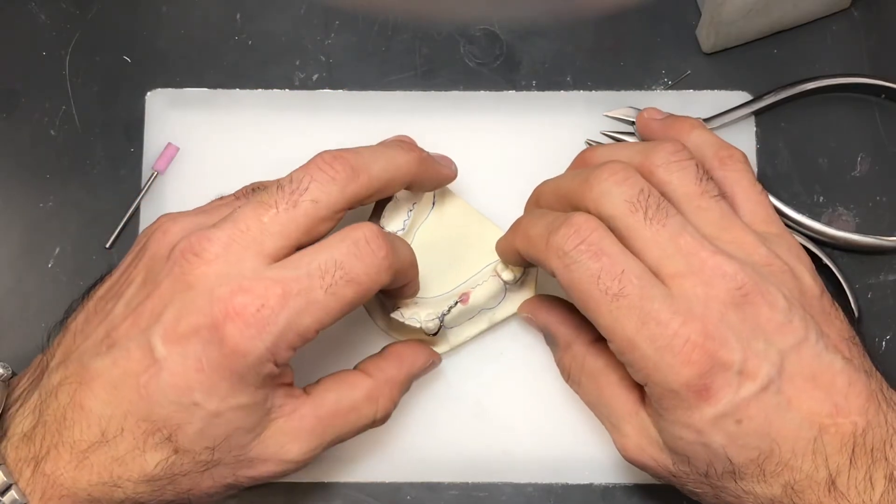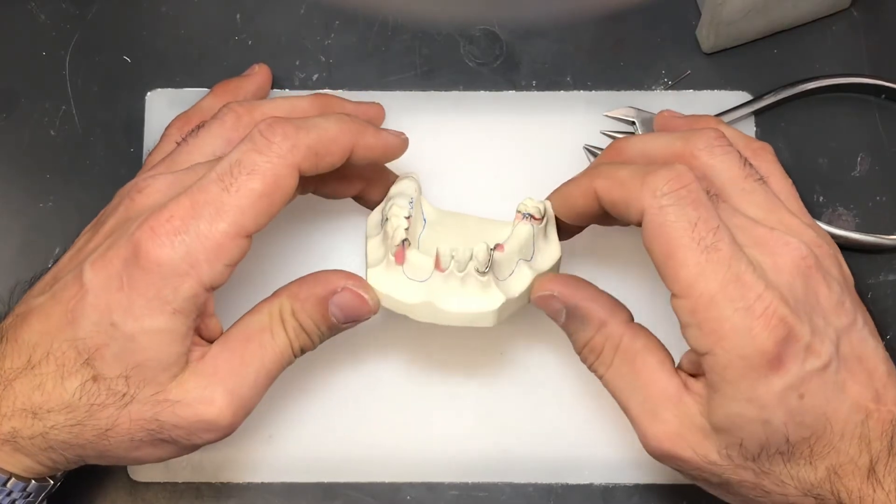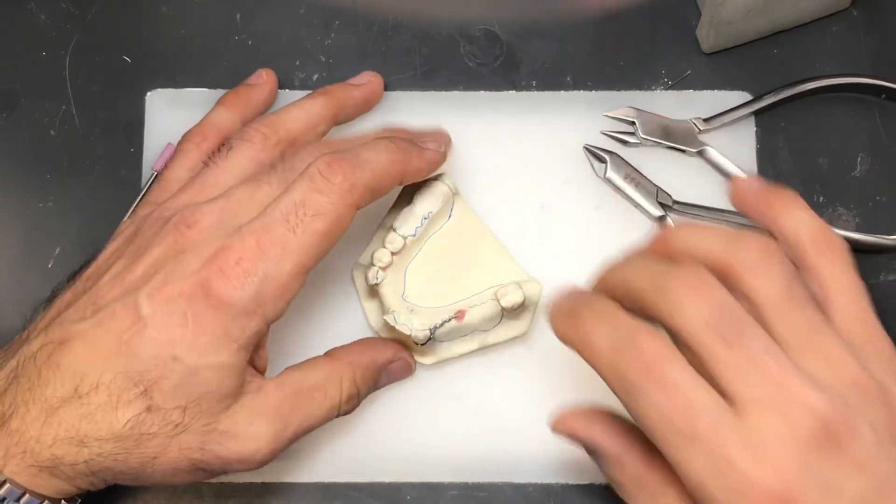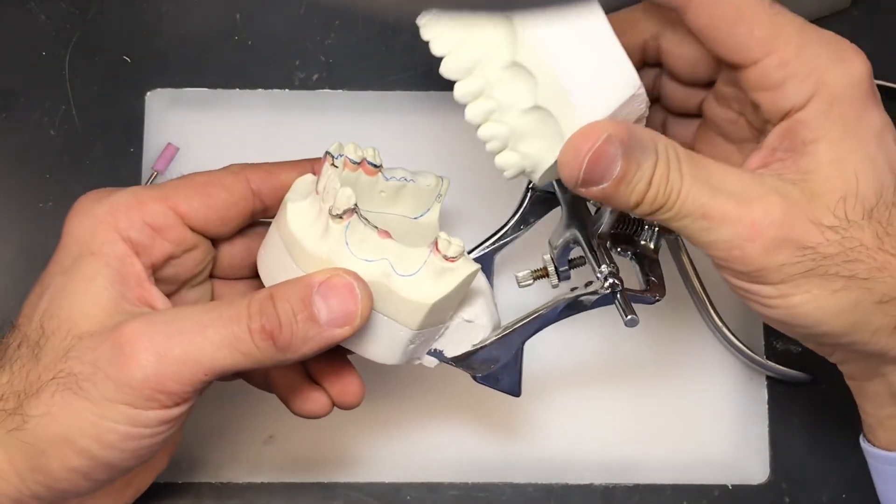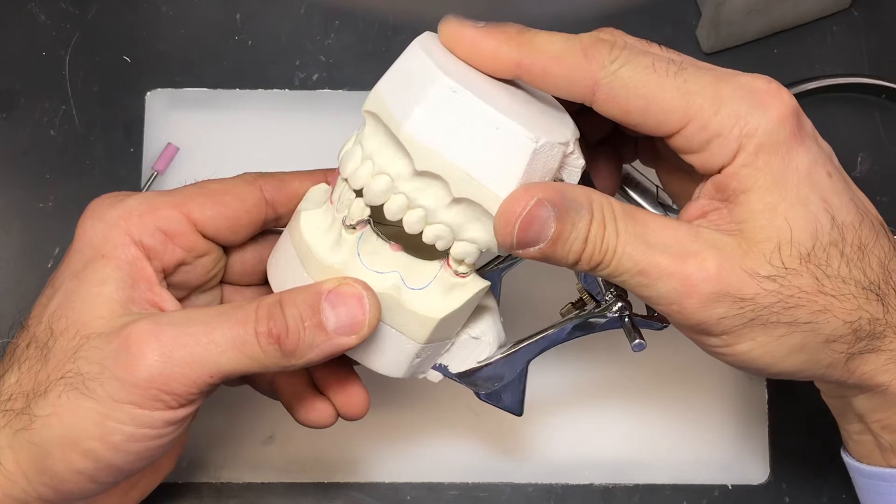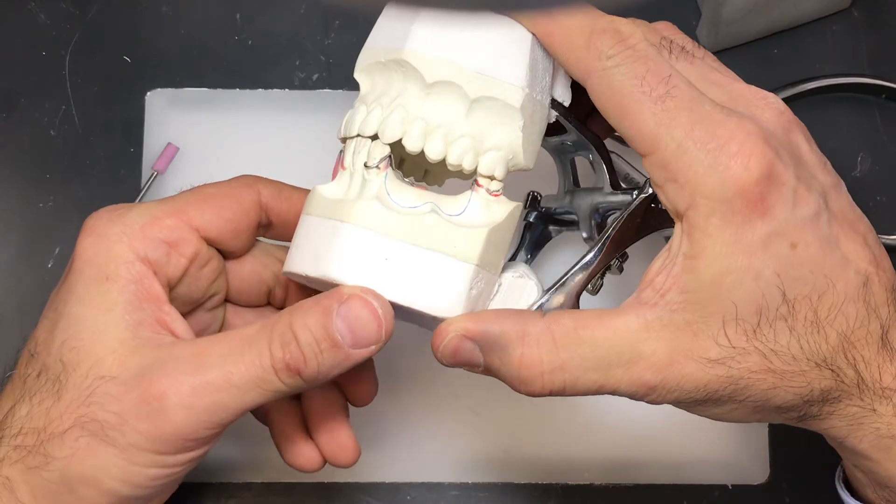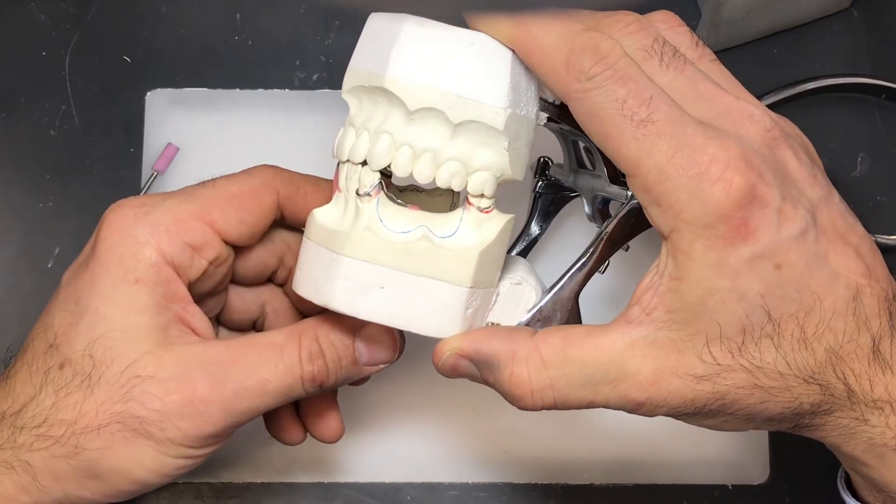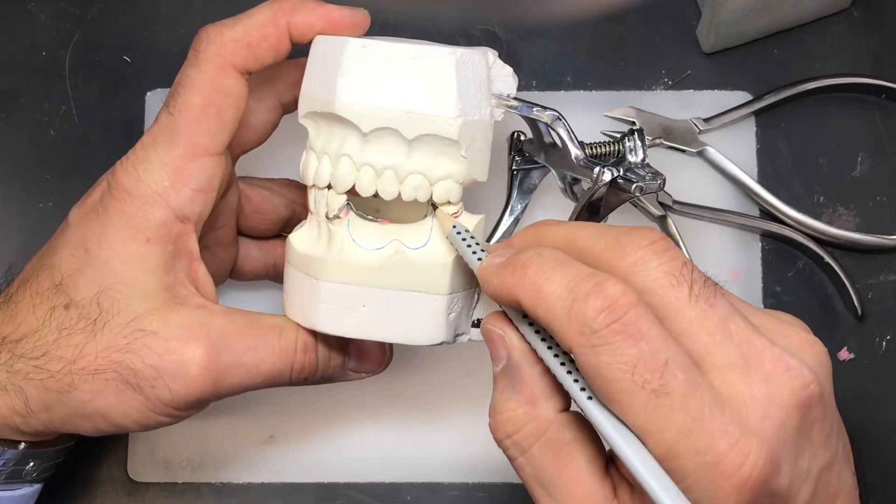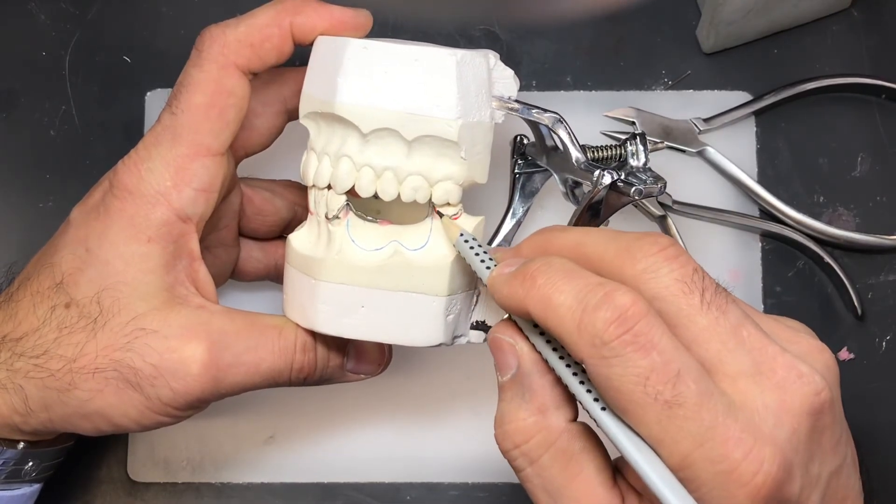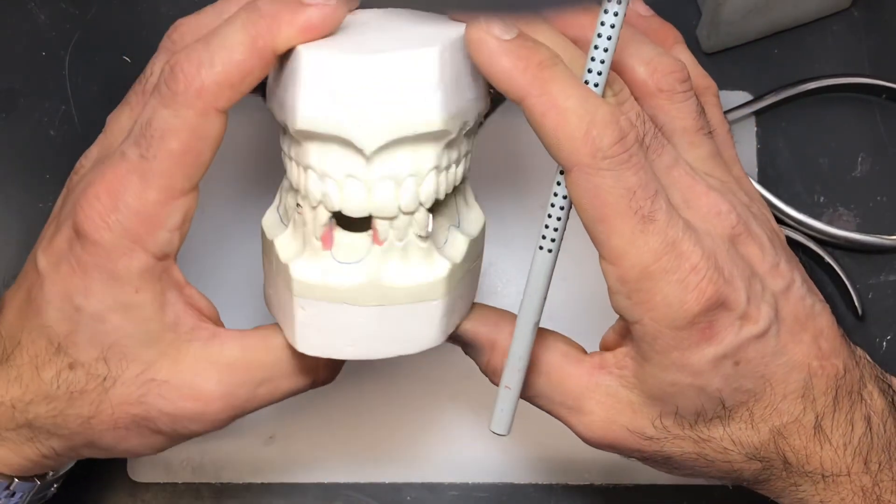We'll see how everything fits and looks up against the opposing. Once more on that subject, make sure that you put your model back onto your mounting and assess that you have clearance of the opposing arch so there's no interference with the wire. Hopefully you have some space now between the wire and the opposing dentition so you can cover the wire with the prosthetic tooth and it looks a little more aesthetically pleasing.